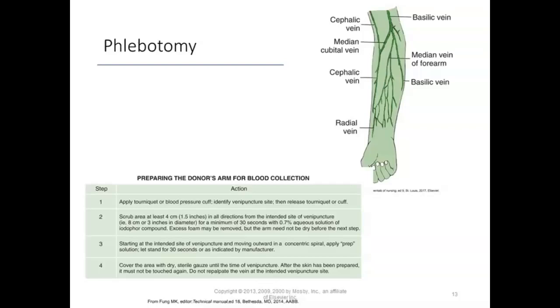So yeah, that's our largest vein, and it's important, because the size gauge needle they use is 16 gauge. Now, if you've never seen it, to look at that needle, it's pretty big. So it's probably about the size of most people's veins.